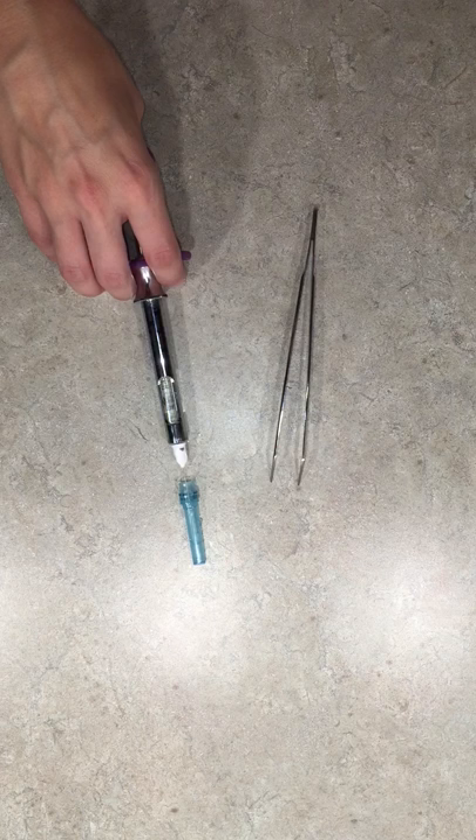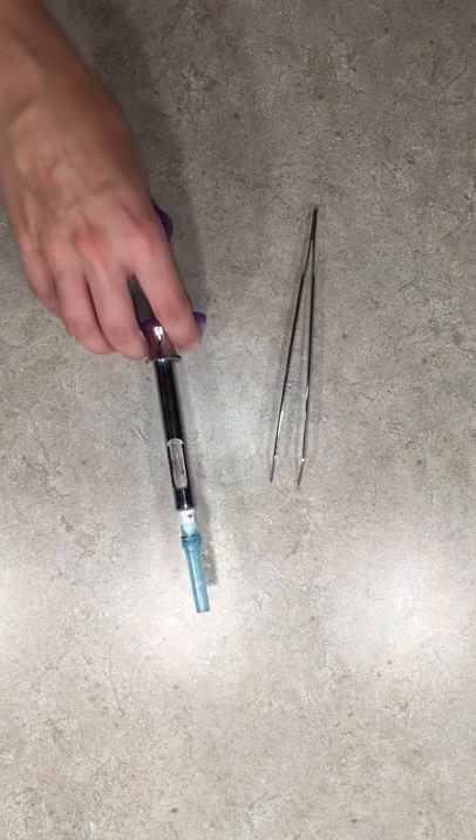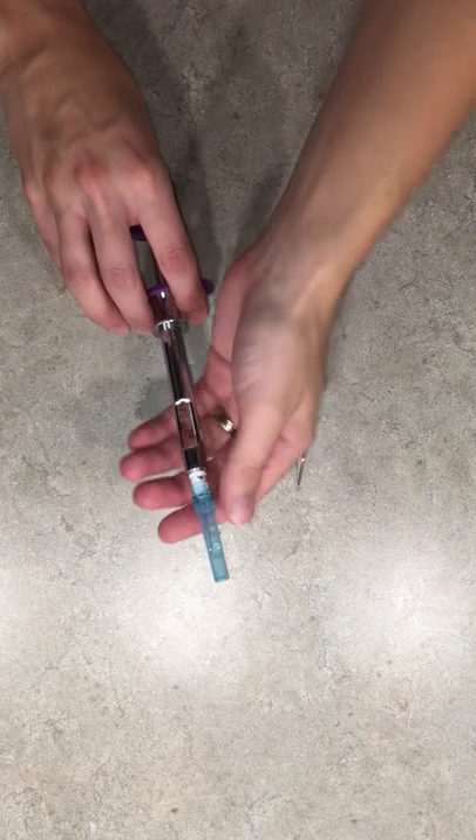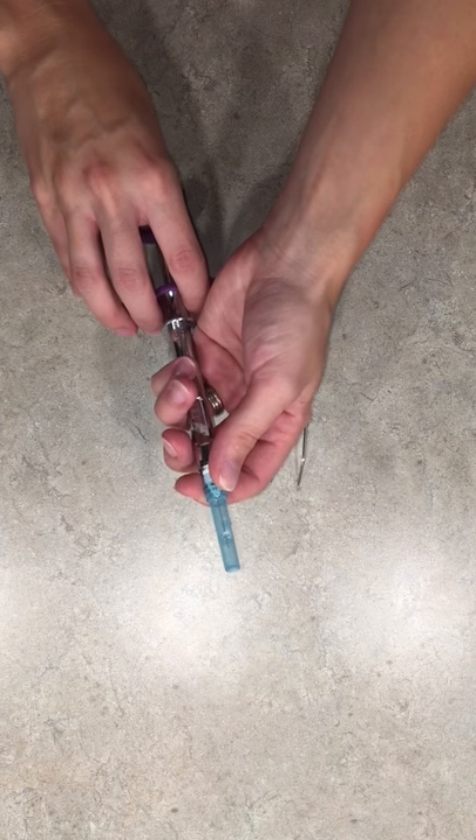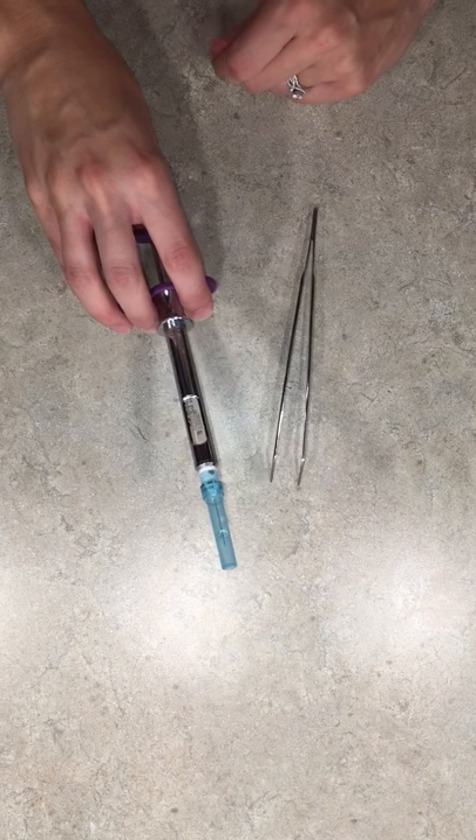Go into the needle sheath, come up slightly vertical, and secure my needle sheath down by the hub here, back onto the needle.